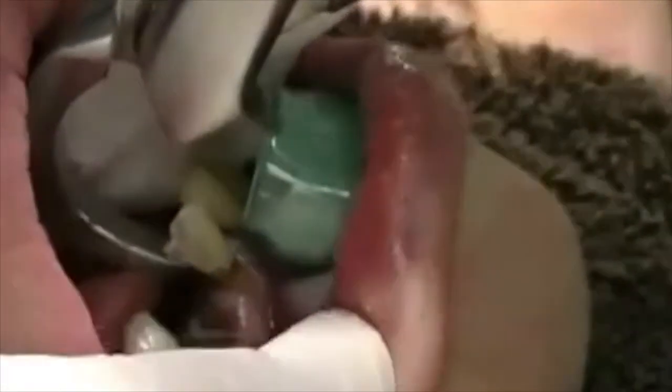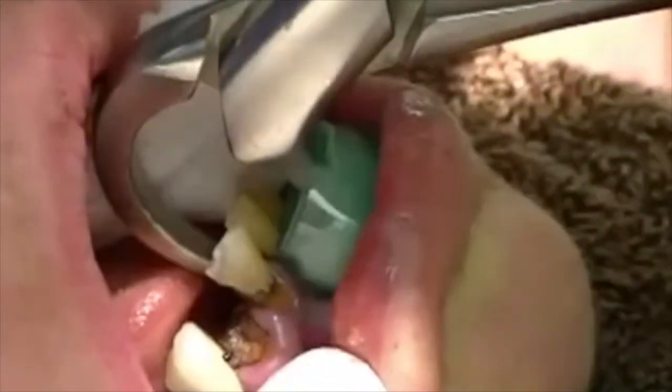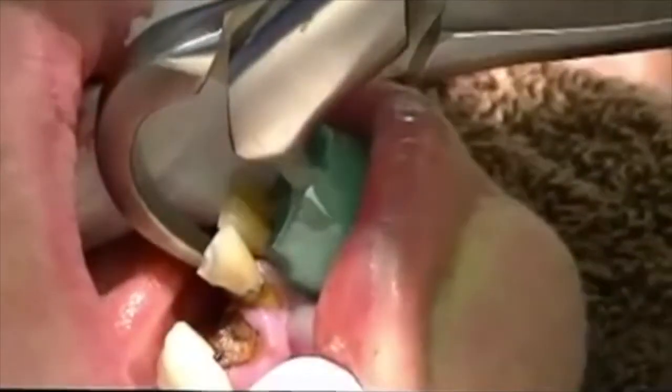So we're simply going to engage — I'm a right-handed dentist using my left hand here — simply engage the lingual surface of the tooth, and I'm simply rotating my wrist. No arm strength whatsoever, just rotating my wrist.